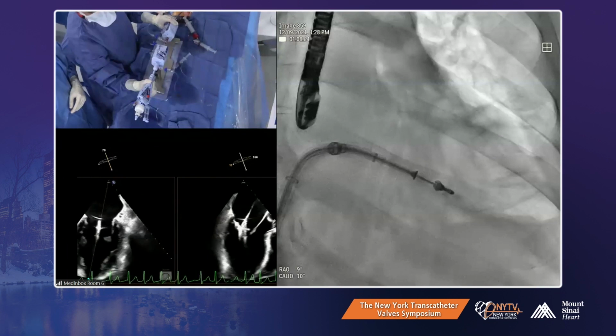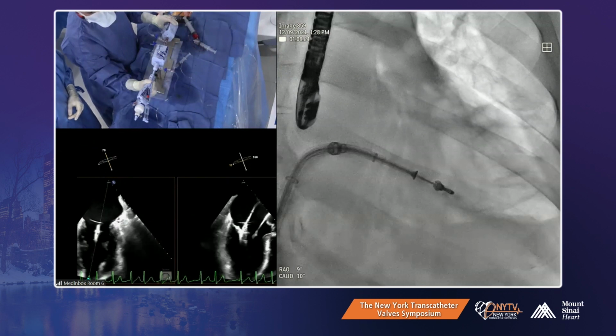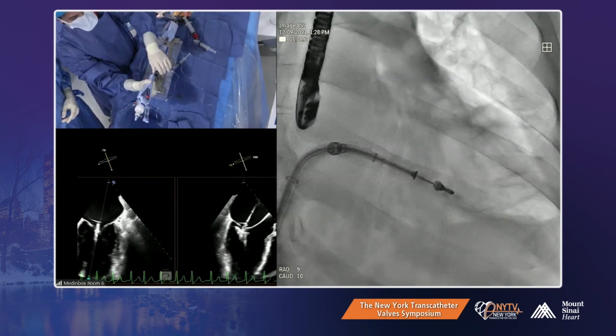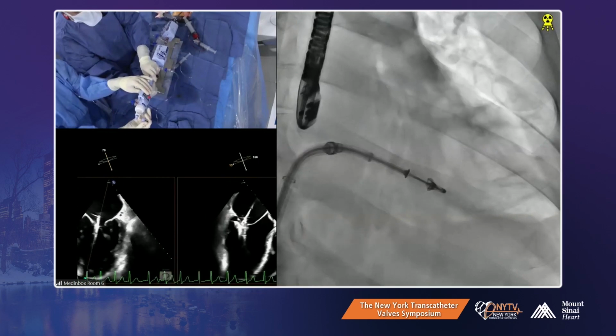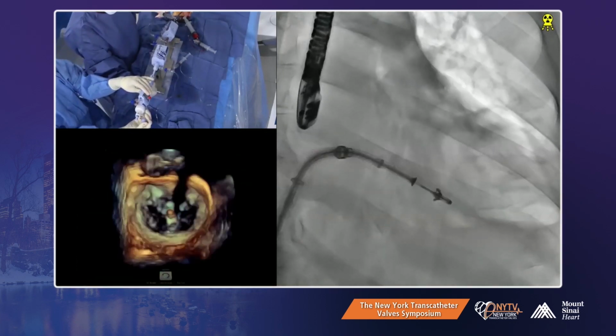Well, we could do one more time on 3D, but you saw the 3D was pretty good. We all thought it could be a little more clockwise. Okay, we'll clock a little bit. We just did clock, more clock.